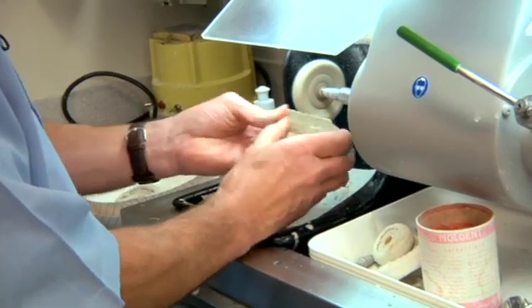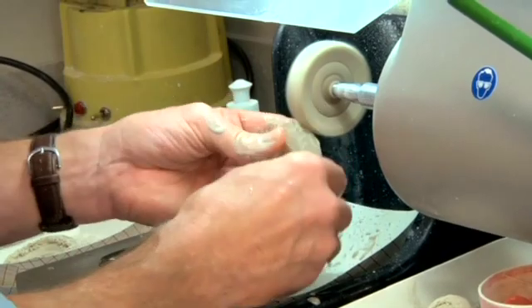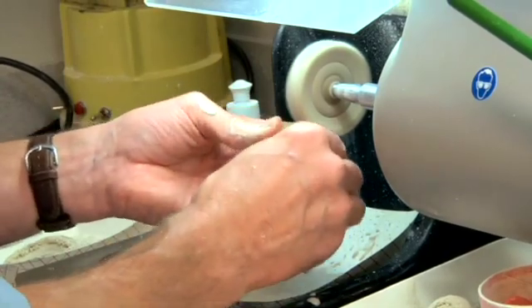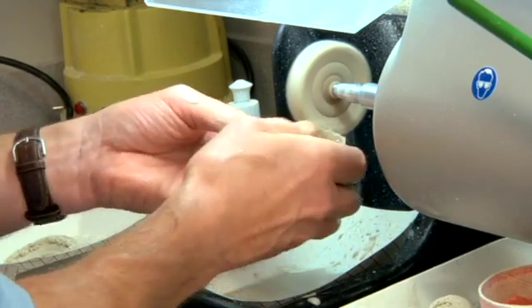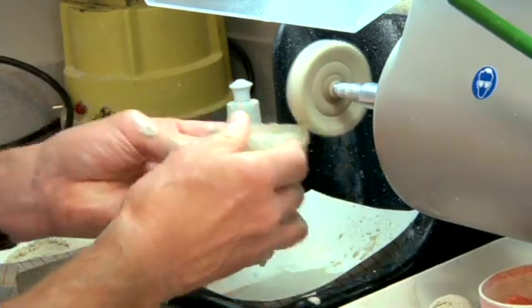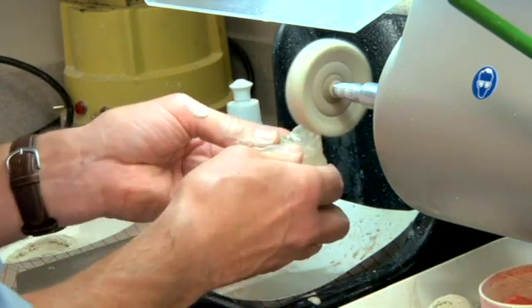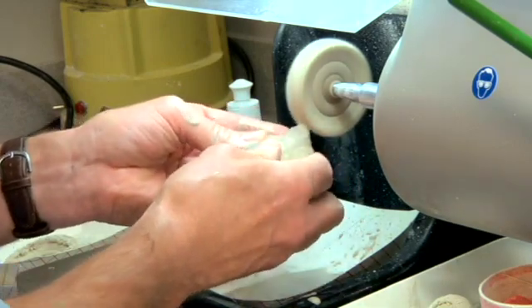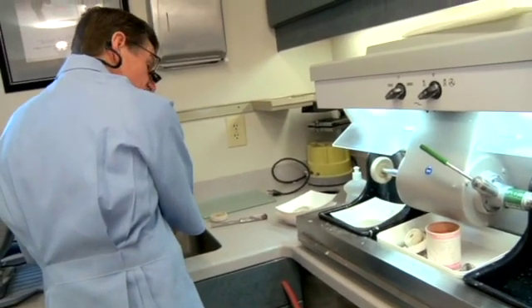Notice I got to rest on my lathe or my countertop. Don't stay on any one position very long. You notice I'm staying off the occlusal surfaces of the teeth. The reason for that is you don't want to heat this acrylic up. I want those borders nice and smooth. We have everything right here by the sink, so I can just rinse it off real quick.